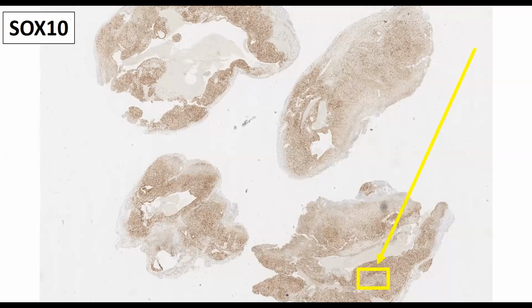Here is the area of interest. Now, listen up. Only this area of all 3 paraffin blocks showed this finding. If you're a quick and dirty pathologist and you take one look at it and make an instant schwannoma diagnosis, and if you knew it was a dumbbell tumor, right?